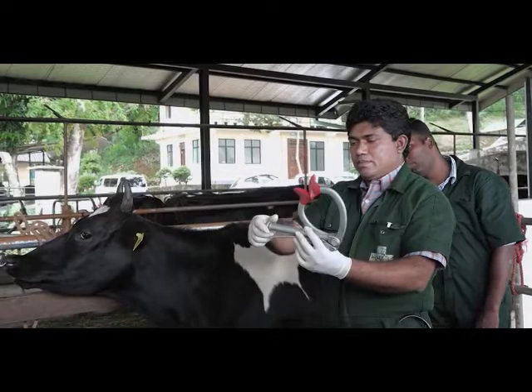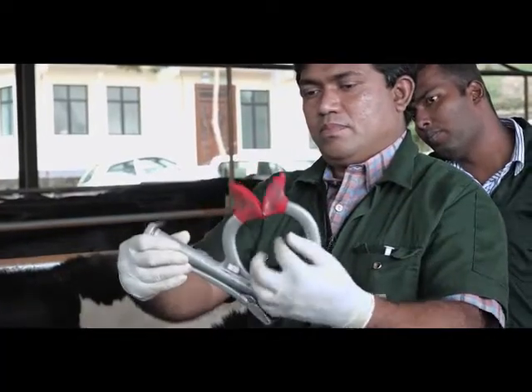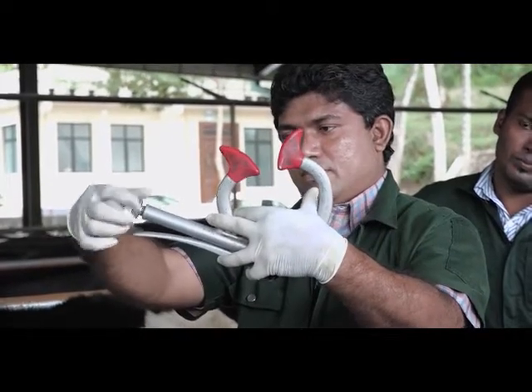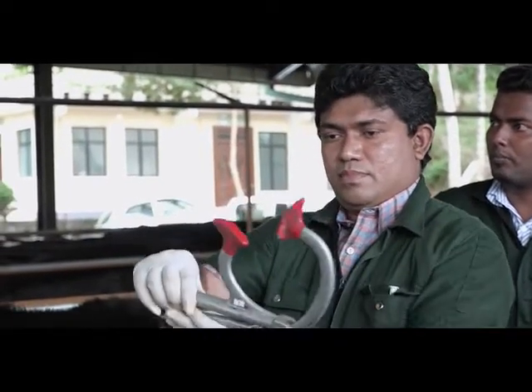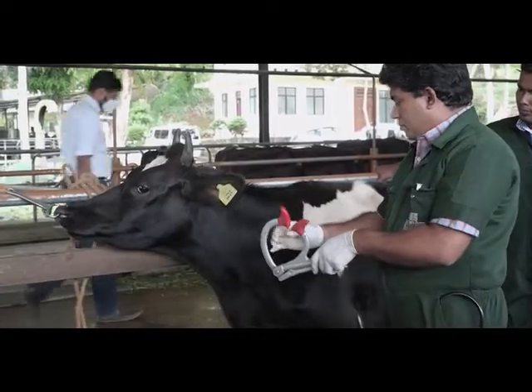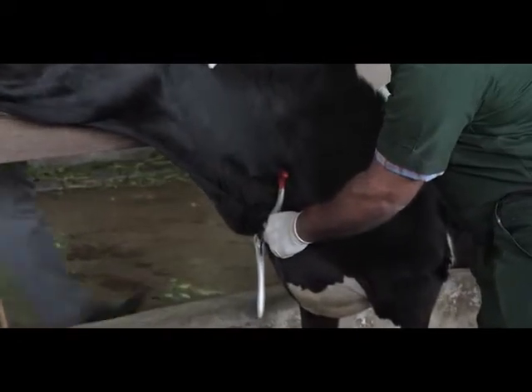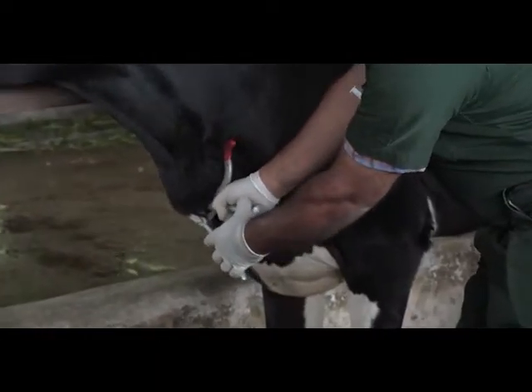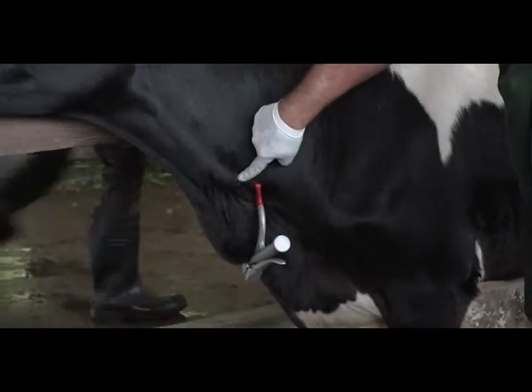Alternatively, you can use the jugular clamp to arrest the jugular vein. The jugular clamp has two arms and a knob to adjust the gap between the two arms. Depending on the thickness of the neck, make sure to adjust this gap. As shown here, apply the jugular clamp at the level of the thoracic inlet above the level of the jugular furrow, so it gradually slips into the jugular furrow, compressing the vein. Now you can see the bulging of the vein.